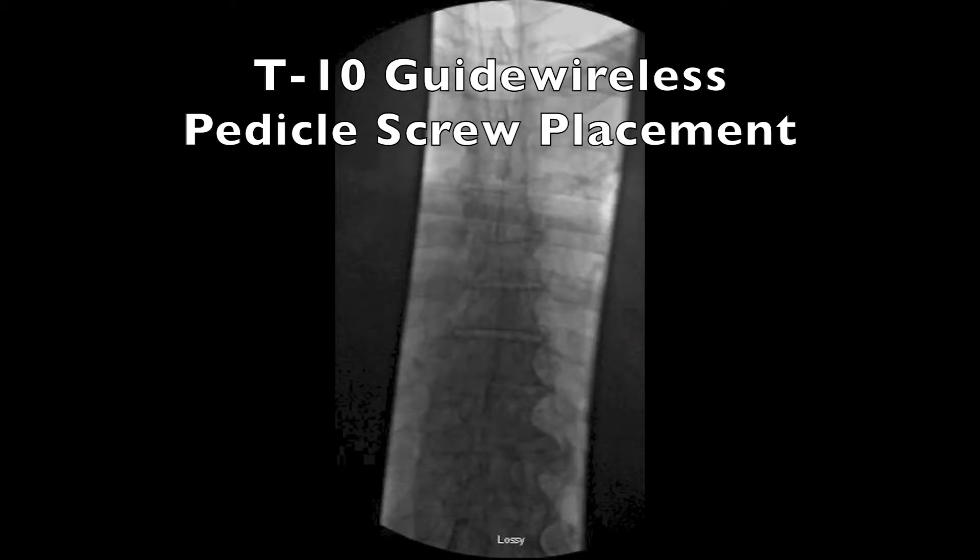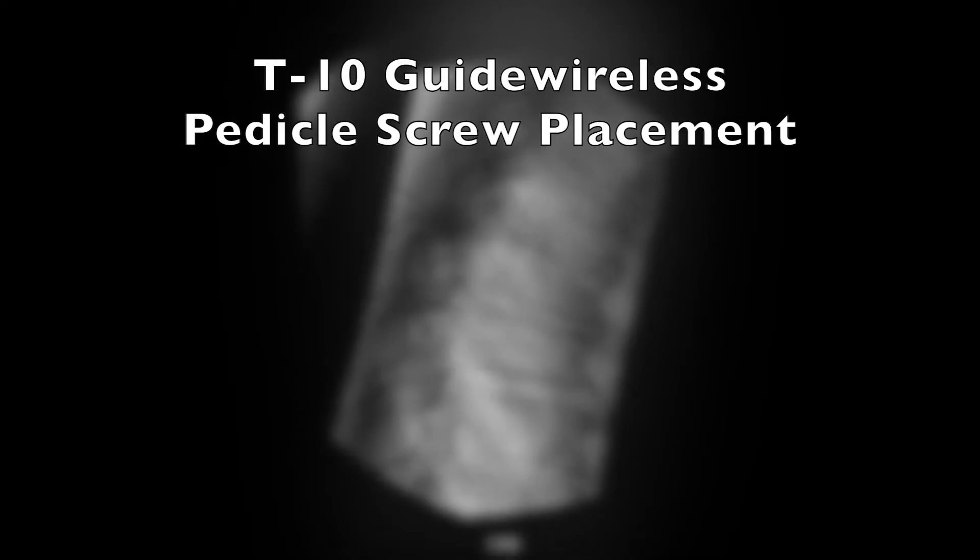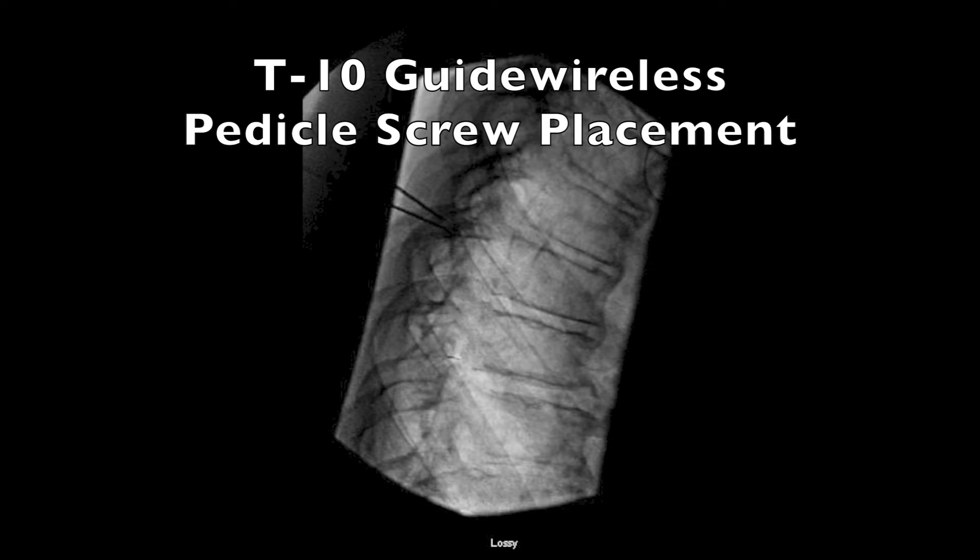This is a video demonstrating the technique of placing a guidewire-free pedicle screw under biplanar fluoroscopy in the left T10 pedicle, by Drs. Joshua M. Beckman and Juan S. Uribe from the University of South Florida. This is an advanced technique and should only be performed by surgeons who are experts in spine surgery.